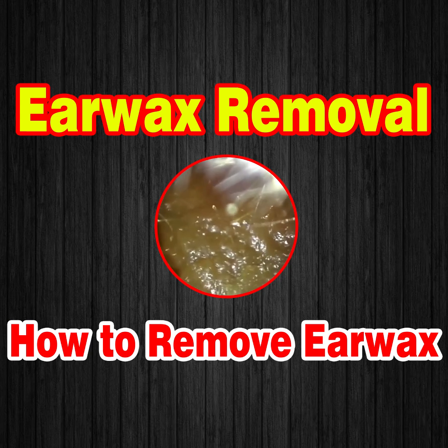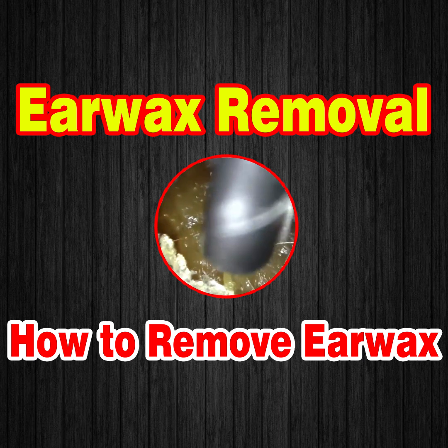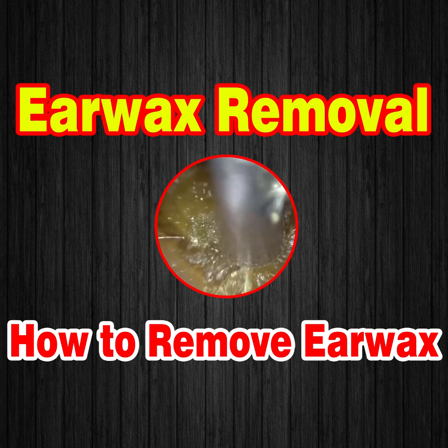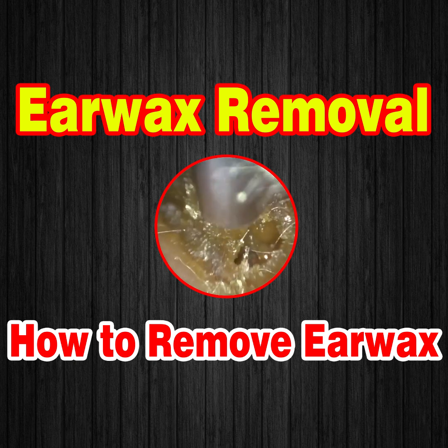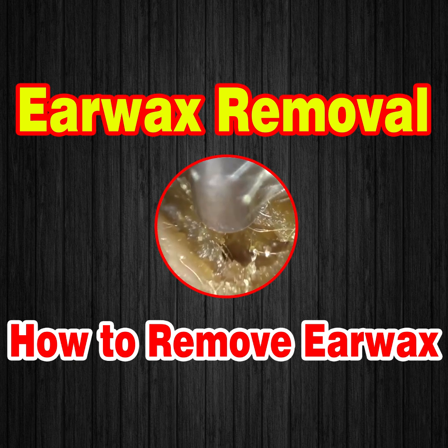Aural polyp. Now it may just be a fibroepithelial polyp, it possibly be a keloid, but it looks a bit too rough. It's not moist and damp, so it's not discharging. But with any form of skin type like that or aural polyps, they do need to be investigated further just to ensure they're not malignant anyway. So we have referred this patient onwards.